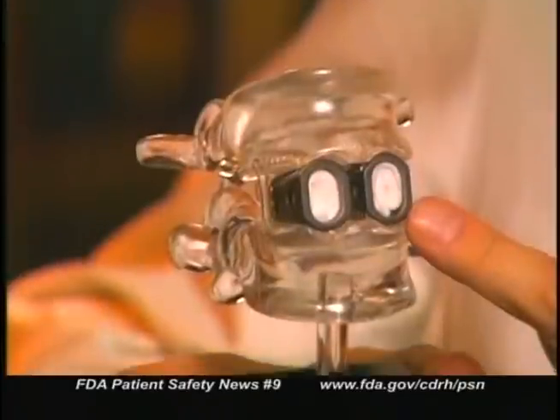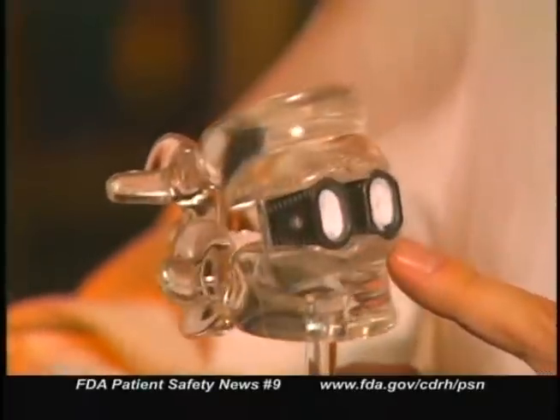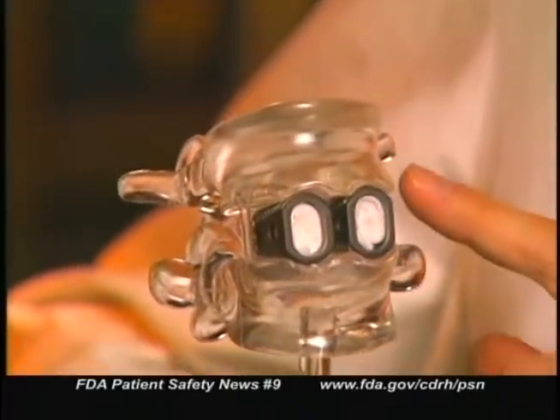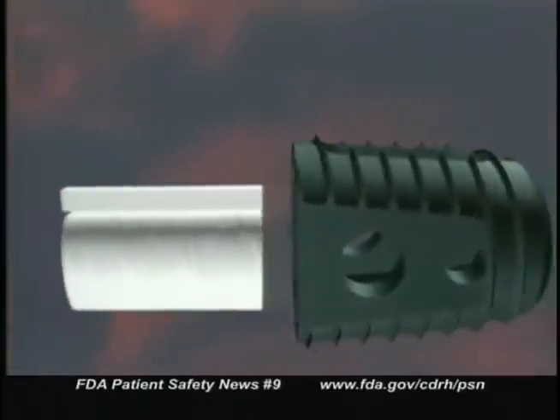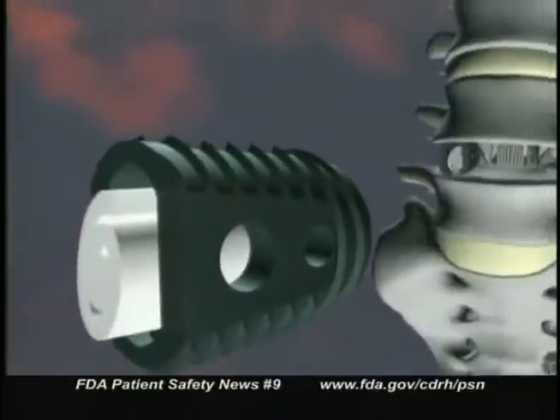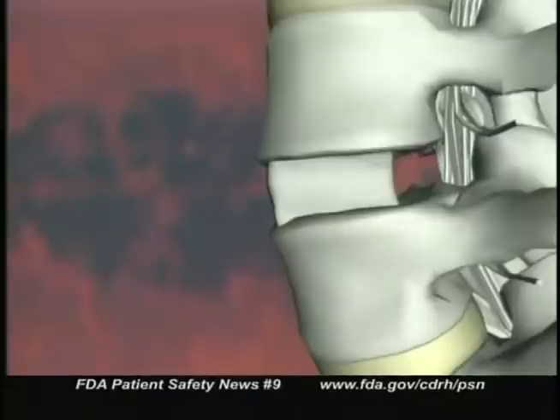Conventional devices generally use a bone autograft taken from the patient's own hip. This device is made by Medtronic Sofamor Danek of Memphis, Tennessee, and is made up of several components. One component, called the LT cage, maintains the spacing between the vertebrae and temporarily stabilizes the diseased area of the spine. The other component, called the Infuse Bone Graft, contains a genetically engineered protein that will eventually form bone and grow into the vertebral space, permanently fusing that area of the spine.